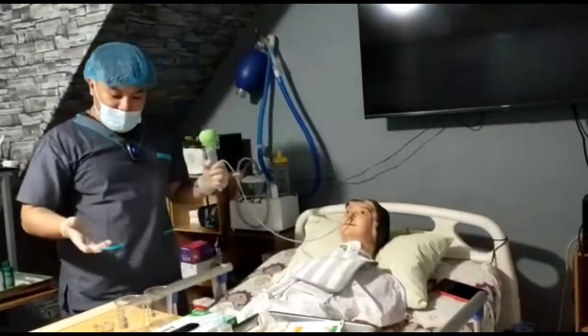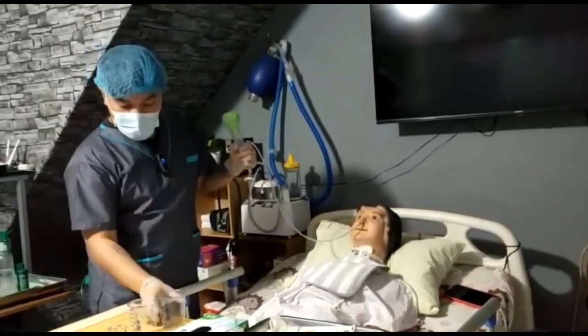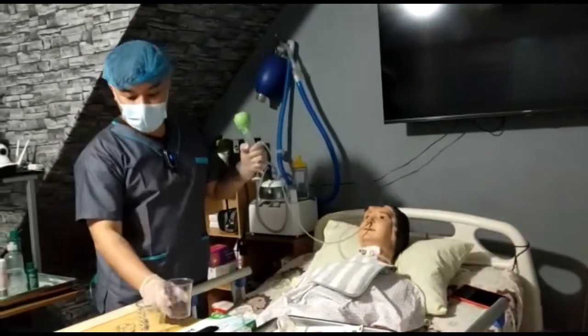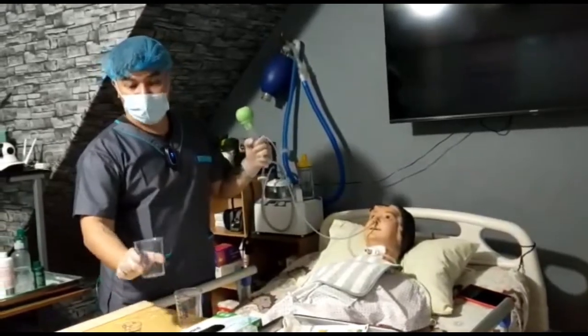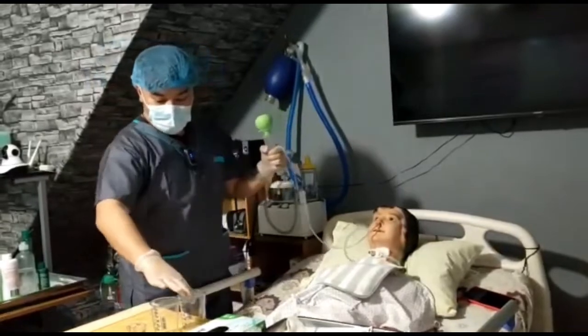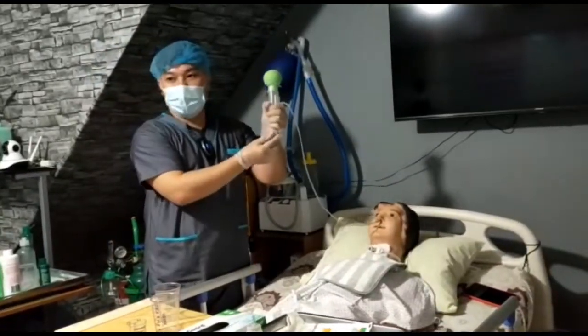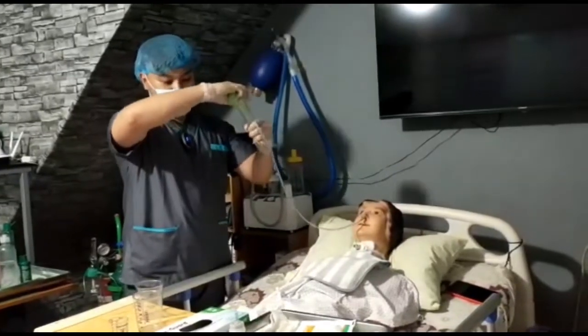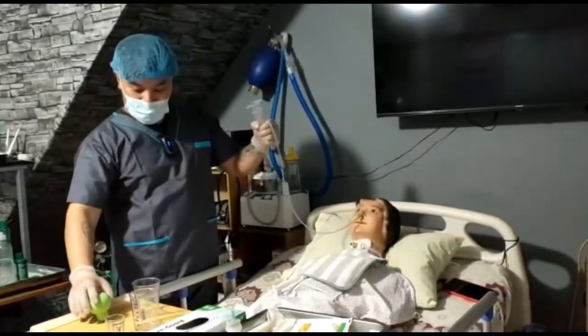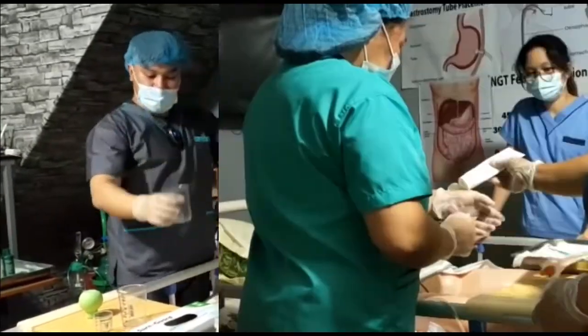Ayan. So, assuming po na itong mga gamit natin dito, this is the water for flushing. We have the OF for feeding and medicine. So, first po gagawin natin is half of the water po is gagamitin natin for feeding. But make sure na laging naka-kink muna to. So, once na i-open natin, for example, maglalagay tayo ng 20 ml water.